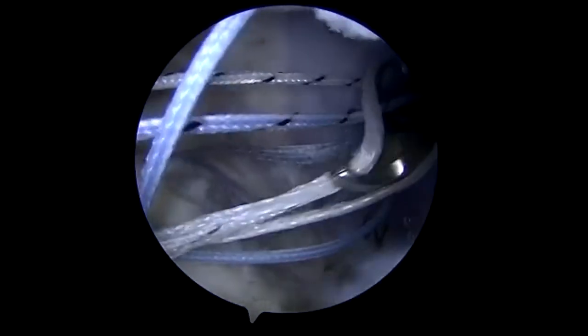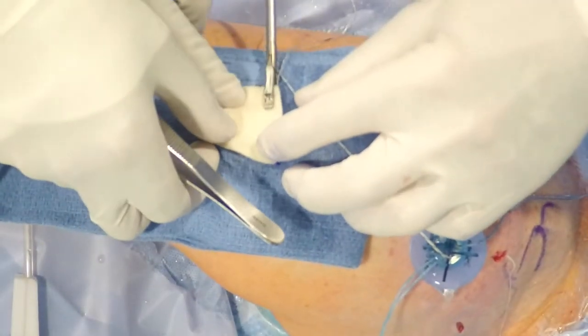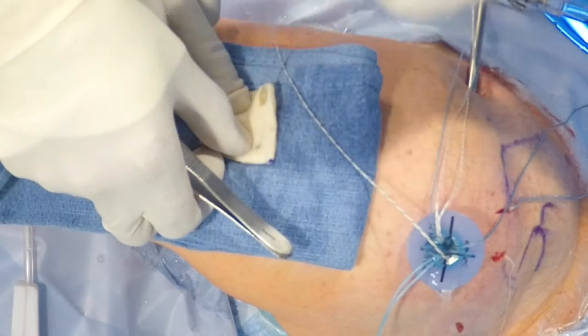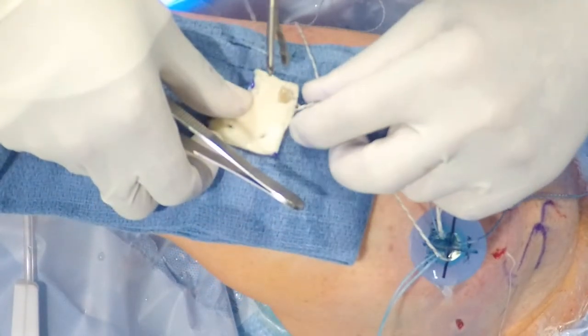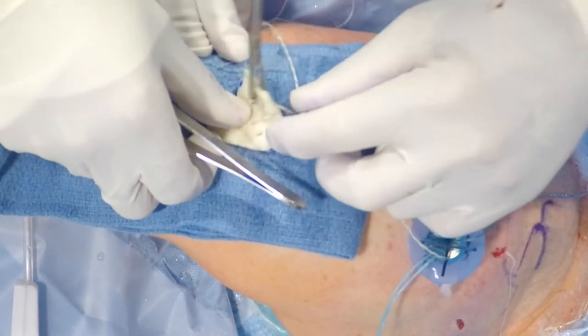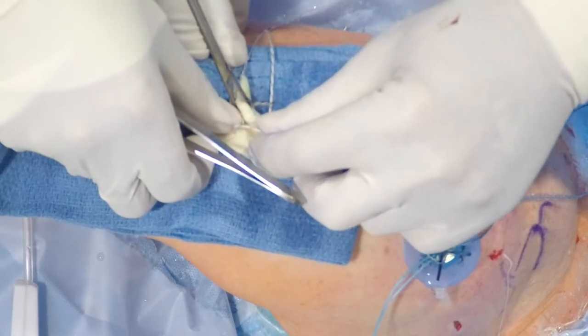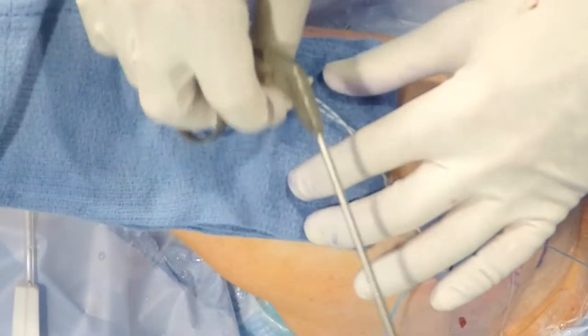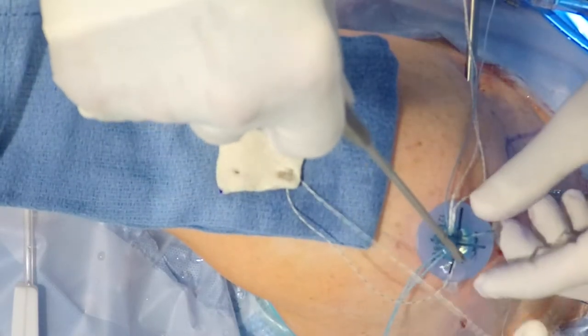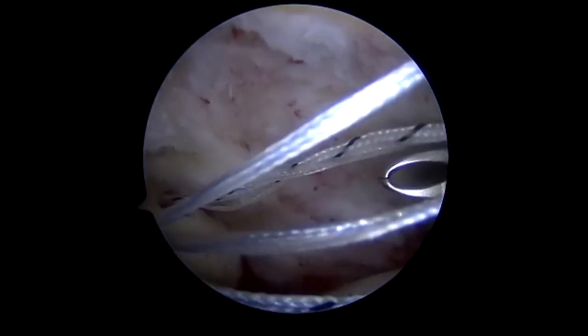This is the shuttling suture that will then be passed through the most medial aspect of the dermal graft. We do this in a manner so that it will essentially be a mattress stitch, so it needs to be passed in two different directions. That is for the anterior glenoid, and we will now be retrieving that shuttle stitch so that we can pull it through the graft.